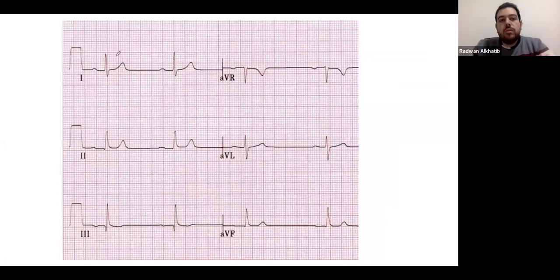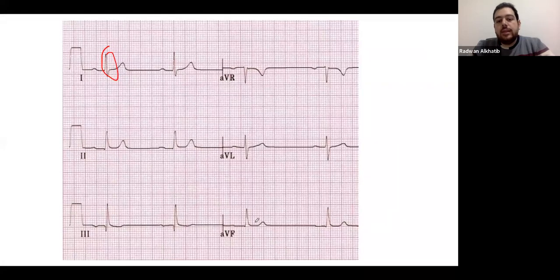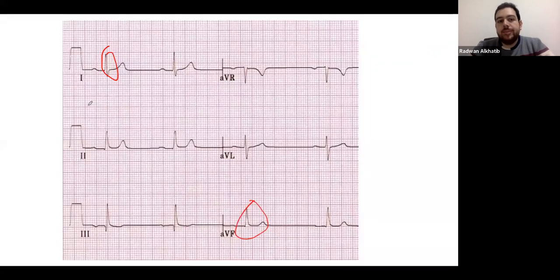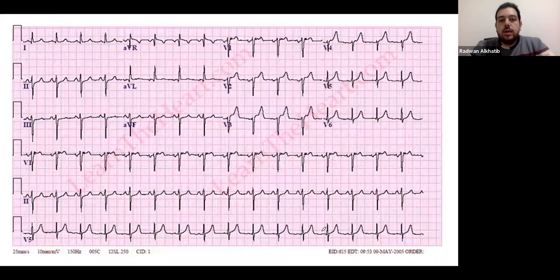That's normal because both lead one and lead AVF are positive, which means both are above the electrical line of the ECG — that is a normal axis. Now looking at another ECG example.